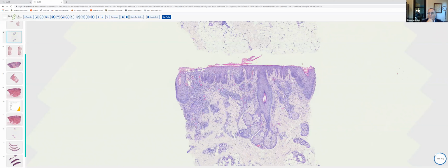Real chronic spongiotic dermatitis frequently demonstrates irregular epidermal hyperplasia, a variably dense infiltrate, and within the cornified layer, not quite as much scale crust. One may see a little bit of serum, and the only clues that one's dealing with the spongiotic dermatitis in that case may be a little bit of intercellular edema. So the bottom line is a chronic eczematous dermatitis may indeed on biopsy just be psoriasiform.